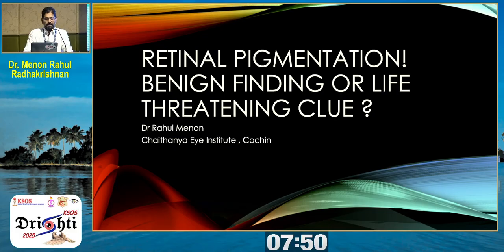Now, why this topic? Suppose a patient comes to you with toxoplasmosis affecting the macula, and you want to send the patient for systemic evaluation. When you convey this to the patient, it feels justified, and the patient is ready to accept it. But many times you see some lesions in the periphery and you don't know what to do. And sometimes it might be a sign of something very sinister.